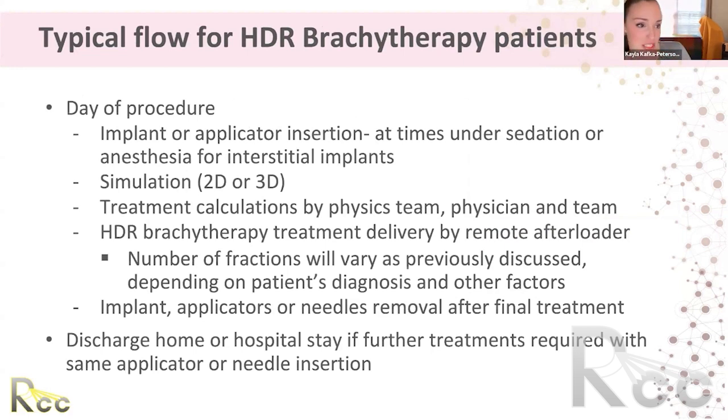So the typical flow for our patients, again, will be the day of the procedure. They'll have their implant or applicator or needles, whatever version you're using, at times under sedation or anesthesia. They'll have that put in. Then they will do the simulation, again, 2D or 3D, to start that planning. The treatment calculations will be done by physics, the physician, and the rest of the team. And then the HDR brachytherapy treatment will be delivered by the remote afterloader. The number of treatments will vary, as previously discussed, depending on what we are treating. And the implant, applicators, or needles will be removed after the final treatment's done. They will either go home or go to the hospital for further stay if they need more treatments with the same applicator or needles.